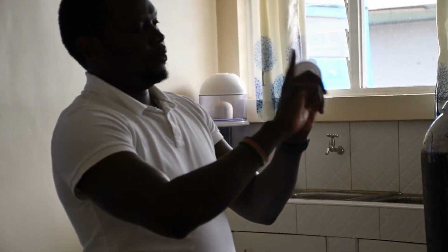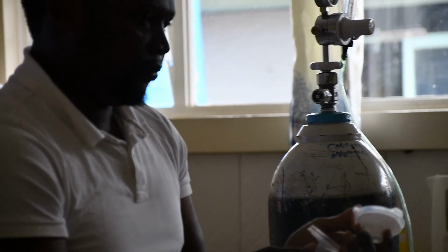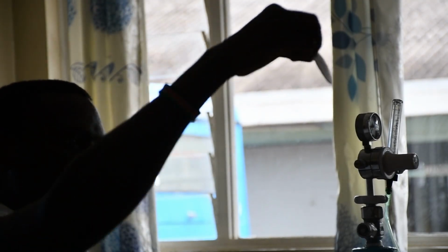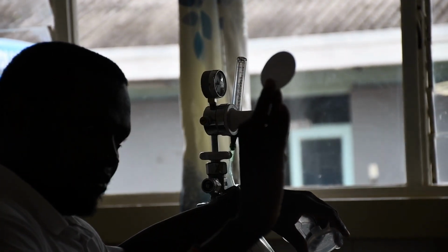To open it up, hold this, and then I want you to pull them down, coming up in opposite directions. So just pull that and then it will open up. Okay? When it opens up, you have this white filter disc. Okay? So this is the disposable part of this filter. This disc has to be exchanged every 24 hours. Okay? Listen carefully. After every 24 hours, you need to change this.